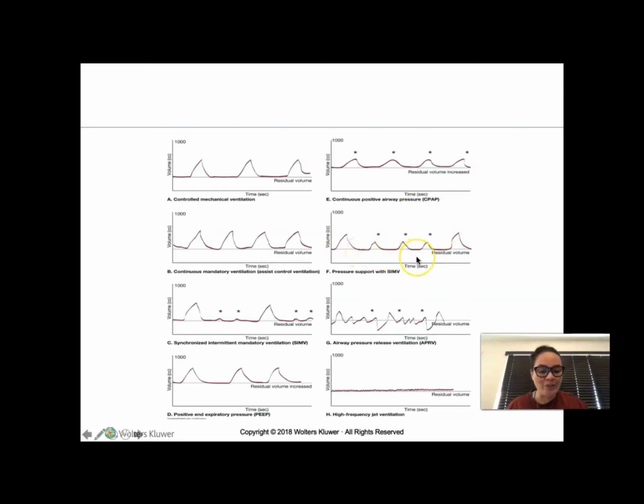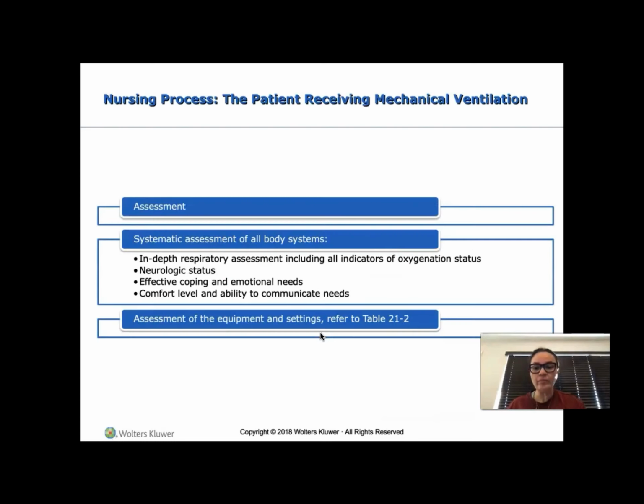And this is where the machine kicks in, all right? And here, okay, synchronized again. Good breath. Not bad, not bad. Boom, okay? So kind of look at it here. All right, the patient receiving a mechanical ventilation.